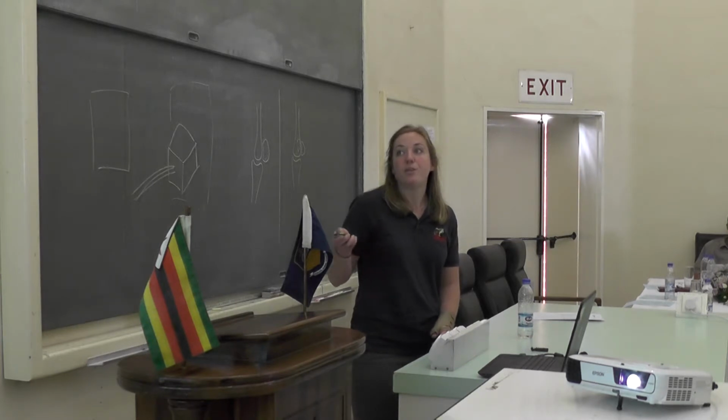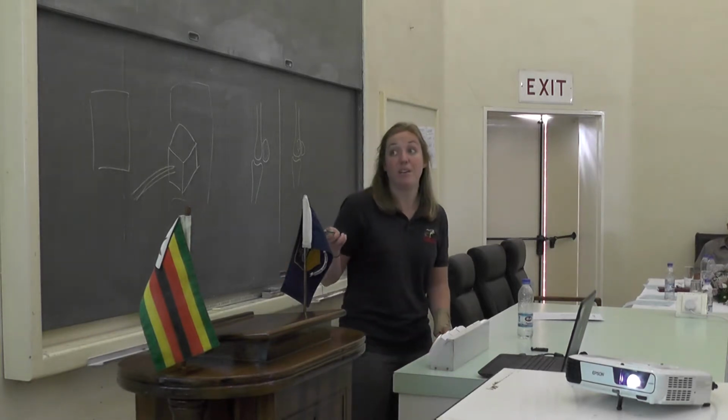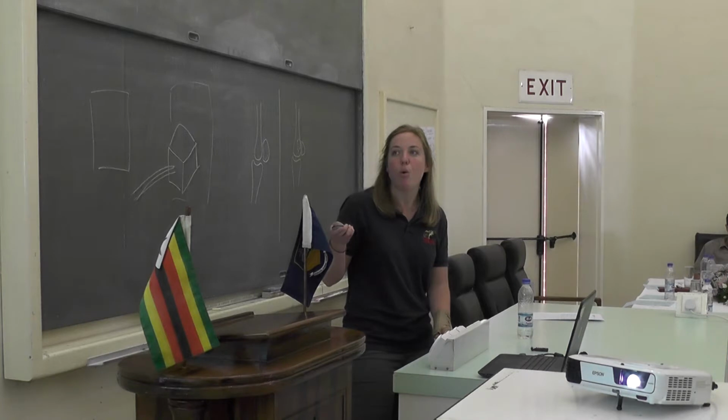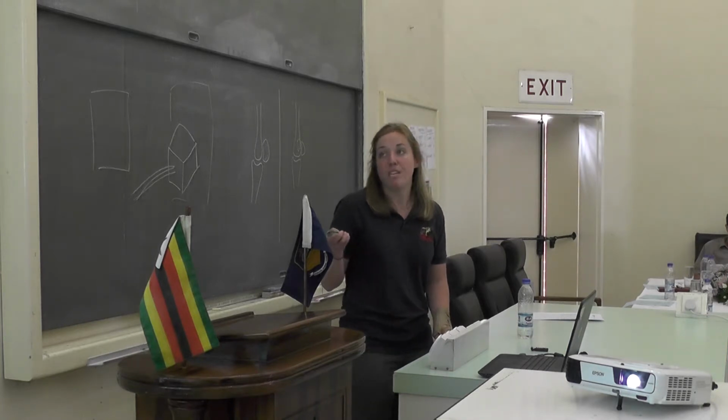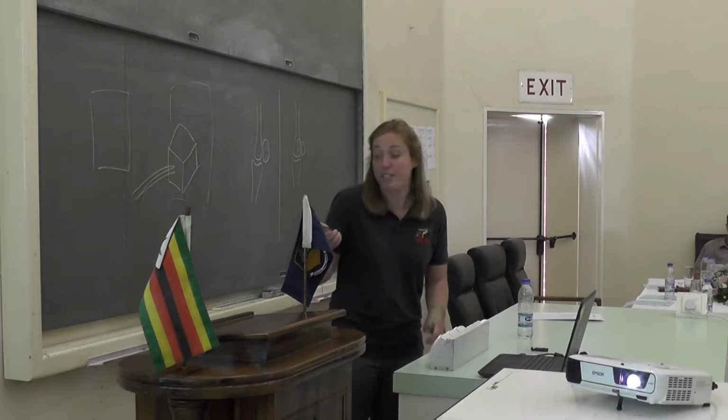And the image that you would get is this, which is actually a much, much better image to evaluate the third phalanx compared to the previous one that I showed you, which is just a plain dorsal palmar. You can see this allows you to see all the margins around, you can pick up fractures and all of that. You miss a lot of the second phalanx because that is superimposed, because what you're trying to do here is highlight the third one. The shorter name for this is upright pedal, because we're putting our pedal bone upright, essentially, to get the shot. But, like I say, this is the exact same thing as doing it this way.